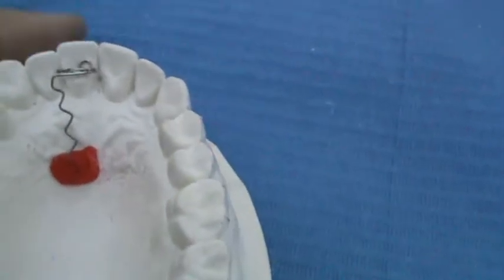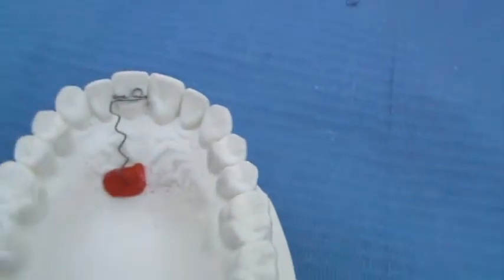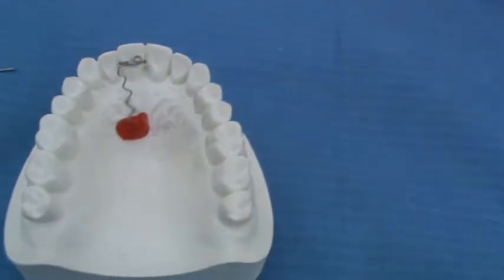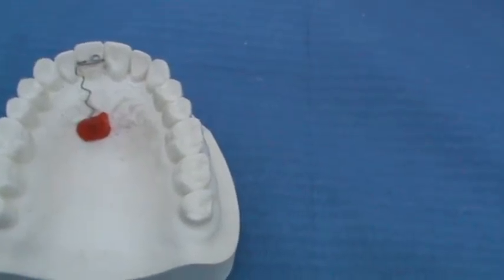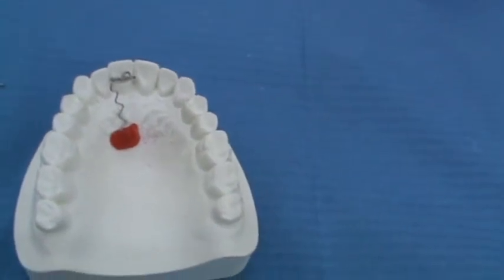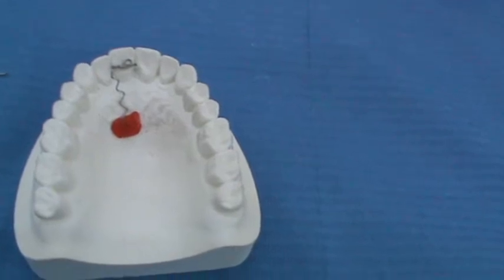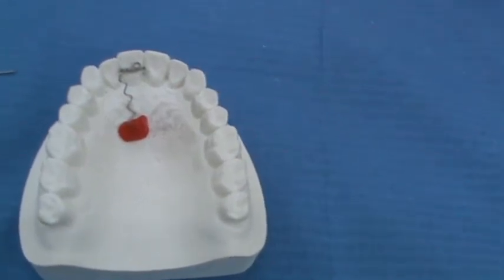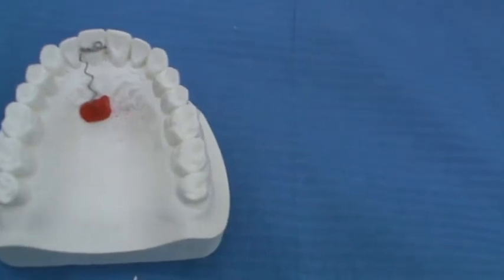The final component is the retentive arm — the part embedded inside the acrylic — which is responsible for the retention of the spring. Inside the acrylic it has a zigzag shape, parallel to the palatal midline. The gauge of the wire is 0.5 millimeter hard stainless steel wire for the incisors, and 0.6 millimeter if you are going to move the canines.